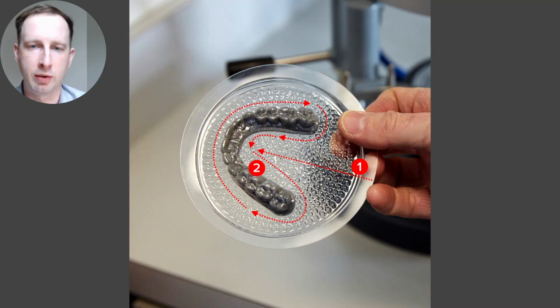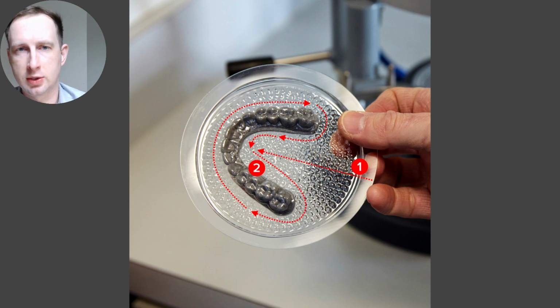You need to cut it out of the sheet and finish it. So there's lots of different ways to make these appliances, finish them, cut them, and everything else. This is the technique that I personally like. I think it's important to note that it will be different for the thickness of material, the brand of material, and what you're comfortable with, right?